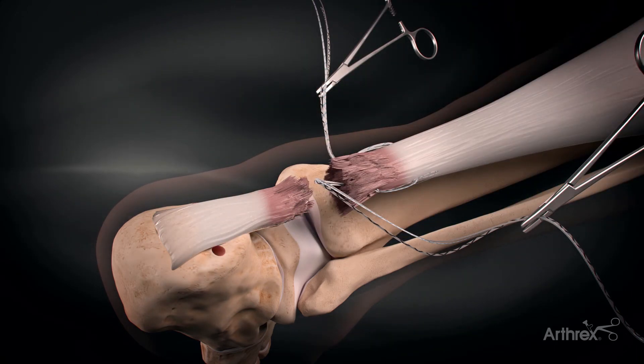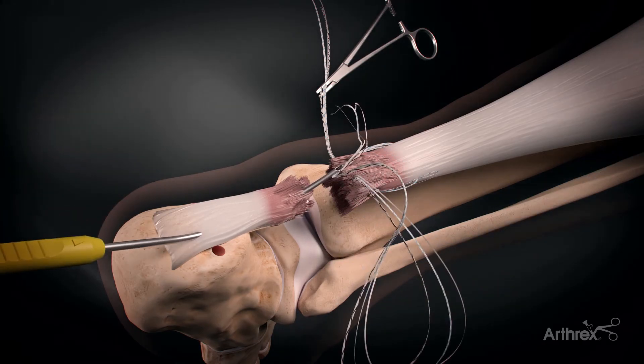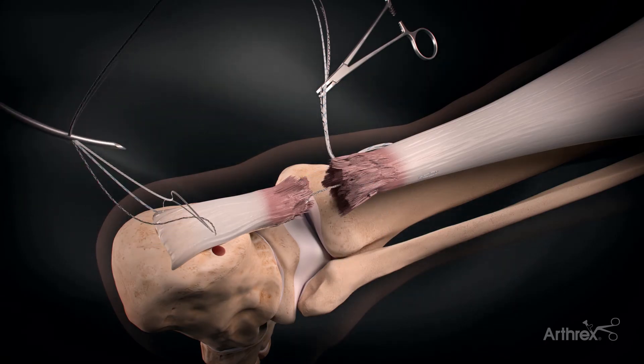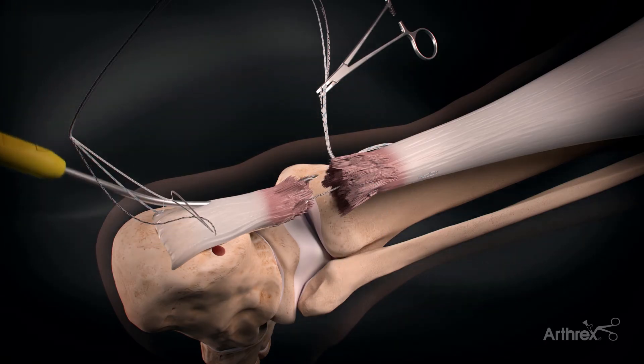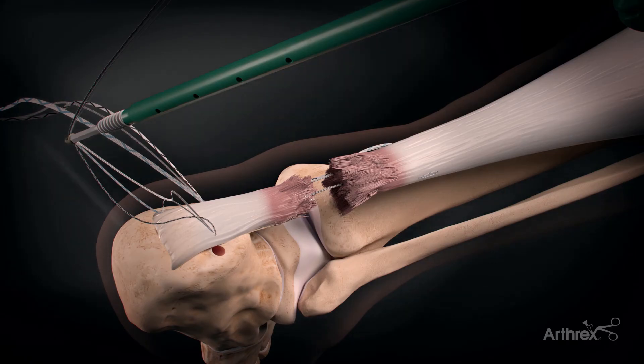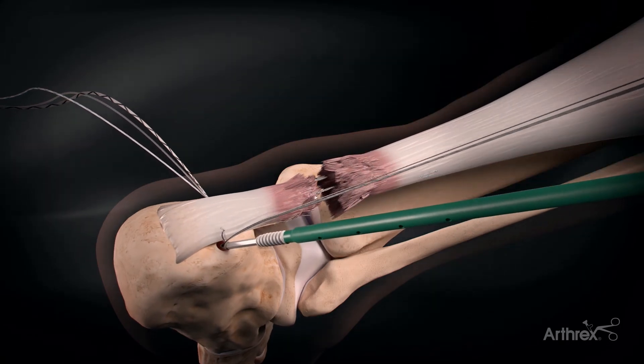After we tap, the suture lasso is passed through the distal stump, capturing the sutures on both the medial and lateral side of the Achilles. Once the sutures are passed, we cycle the Achilles to bring the two stumps together.